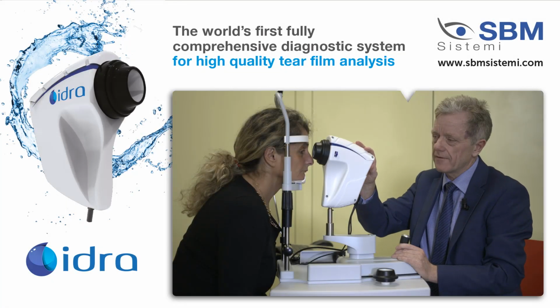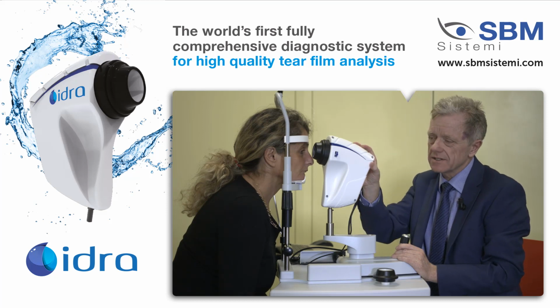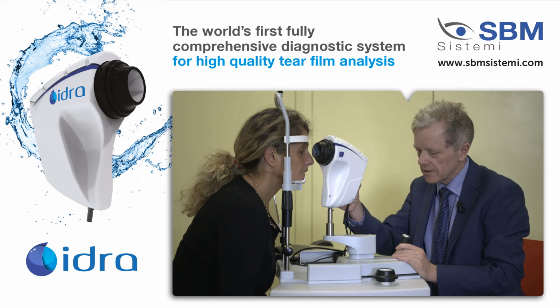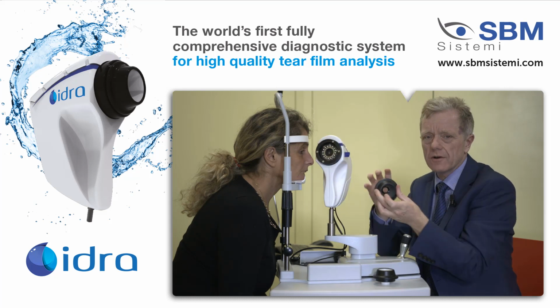Here we have a great new device called the IDRA, which is a dry eye examination and diagnosis. So it's simple and straightforward. It sits on a normal slit lamp application. So here we have the device. We have different heads for different measures.